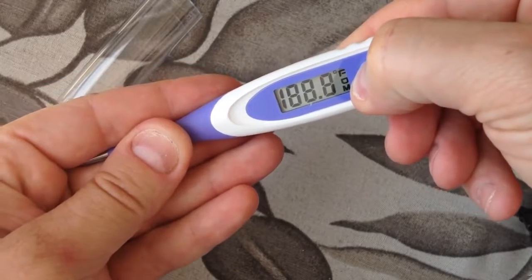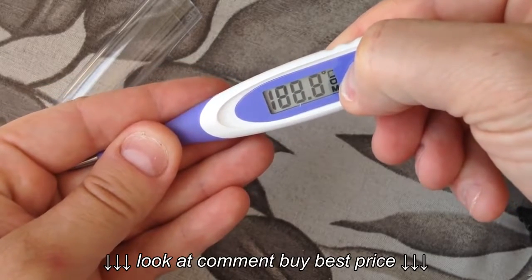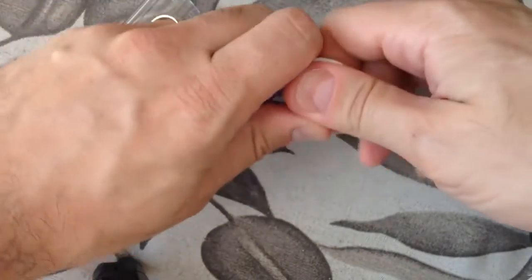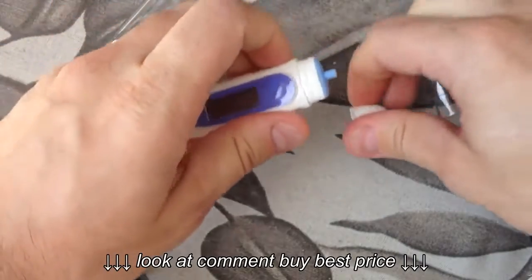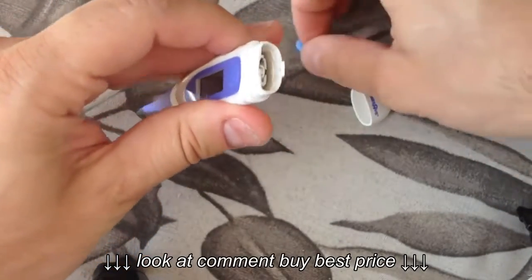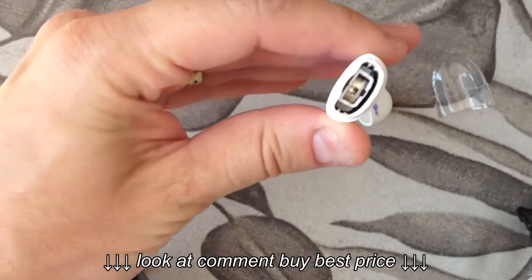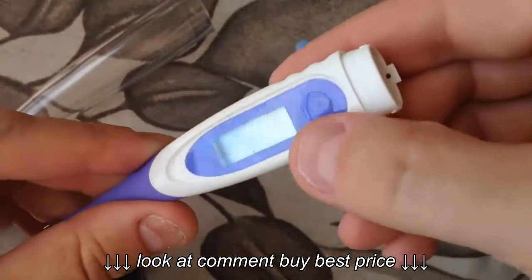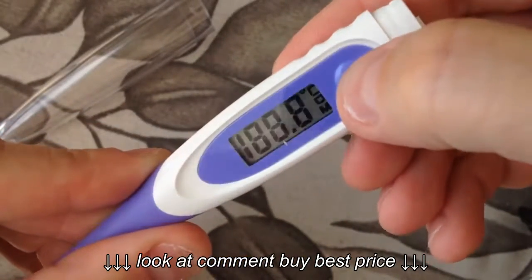Going back to Celsius, and there you go. I could not find this on the internet before so I tried to make the video. Take the cap off — this rubber cap — and you can have access to the battery in case you need to replace it.